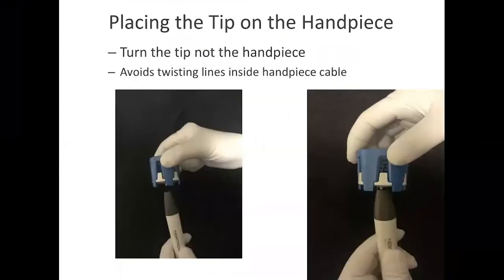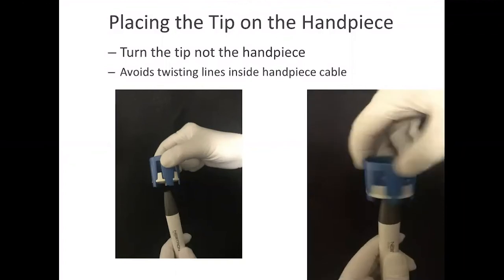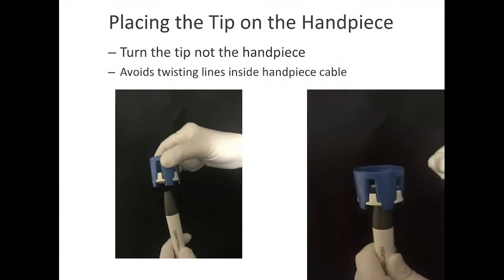When applying the tip, the wrench should be the moving part and the handpiece would be stationary — so it would look like this. By doing so, you avoid twisting lines inside the handpiece cable.